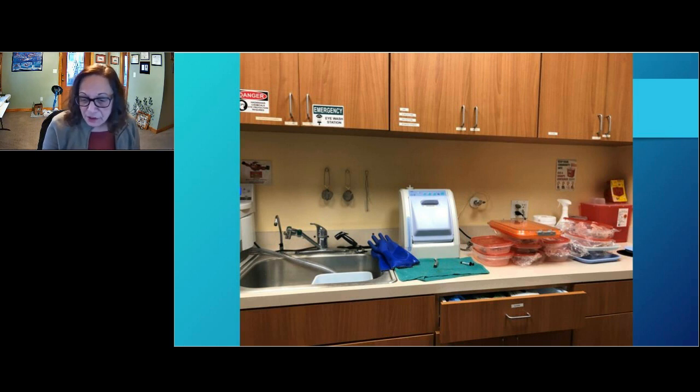Please note, these are cleaned handpieces sitting right next to dirty instruments. That is a great, great risk and potential for recontamination of those handpieces, and you wouldn't even know it. Unfortunately, when organisms jump onto something, it's not like anything lights up or you hear a bell. You don't know.